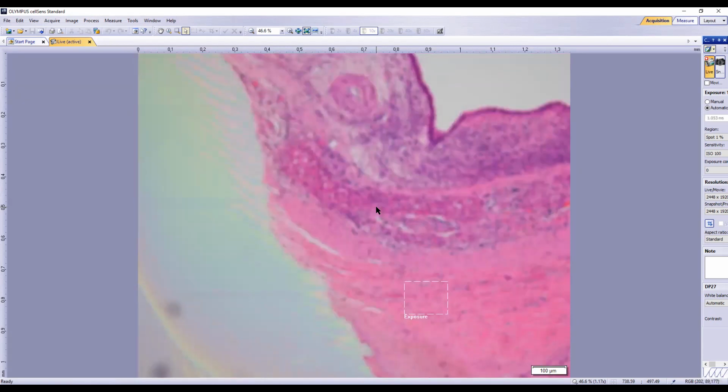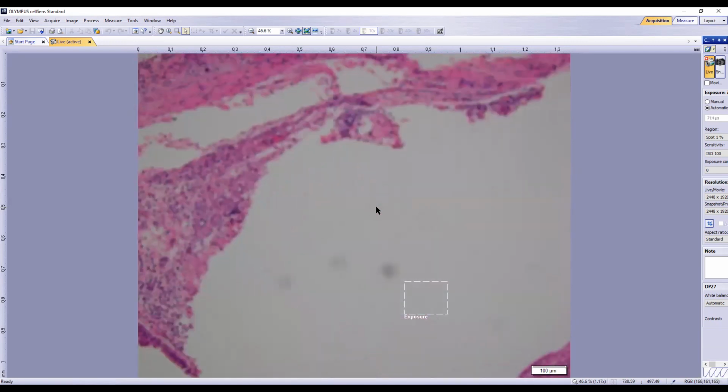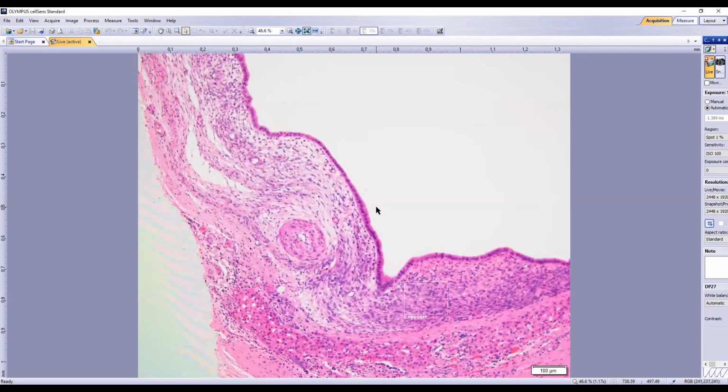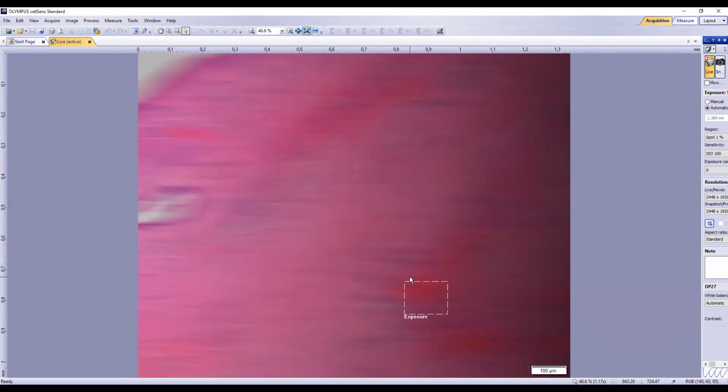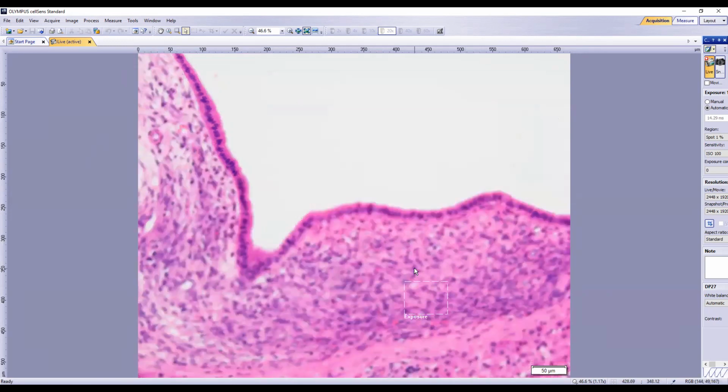The fact that you're seeing ovarian type stroma, what would you do to prove that this is mucinous cystadenoma? So we can prove that it is ovarian stroma by ER, inhibin. Yeah, so you can do ER, PR, and inhibin. The most helpful stain that I've found so far is PR, because somehow the ovarian type stroma in mucinous cystadenomas picks up PR really well. But other stains can be done too. And so if the stroma picks up, then it's more likely to be mucinous cystic neoplasm.